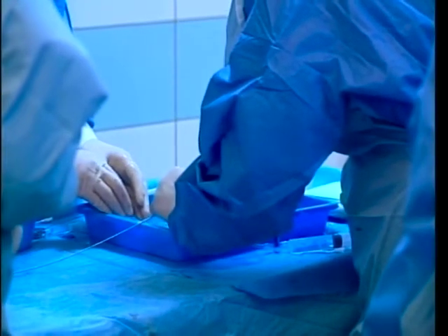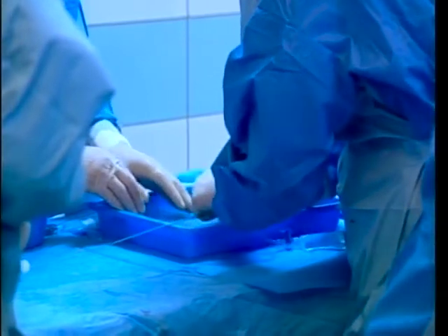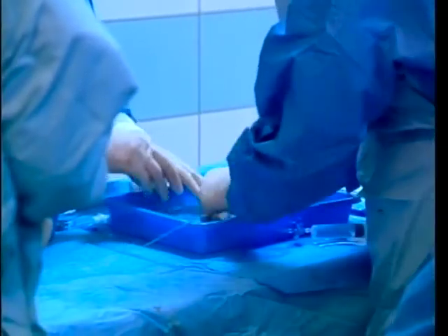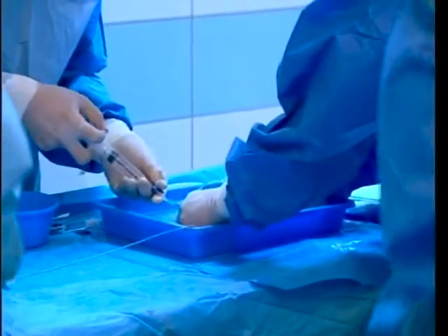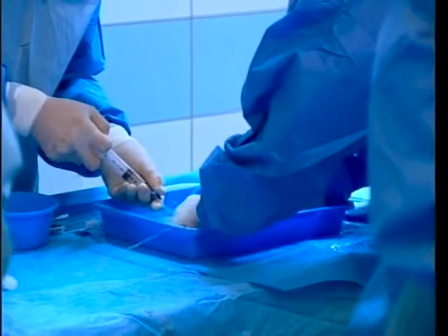So you don't really need to choose a device that stands against the wall. The measurements that Jai-Woon did is actually an arbitrary line. The umbrella should be positioned actually distal to that line instead of at that line level.